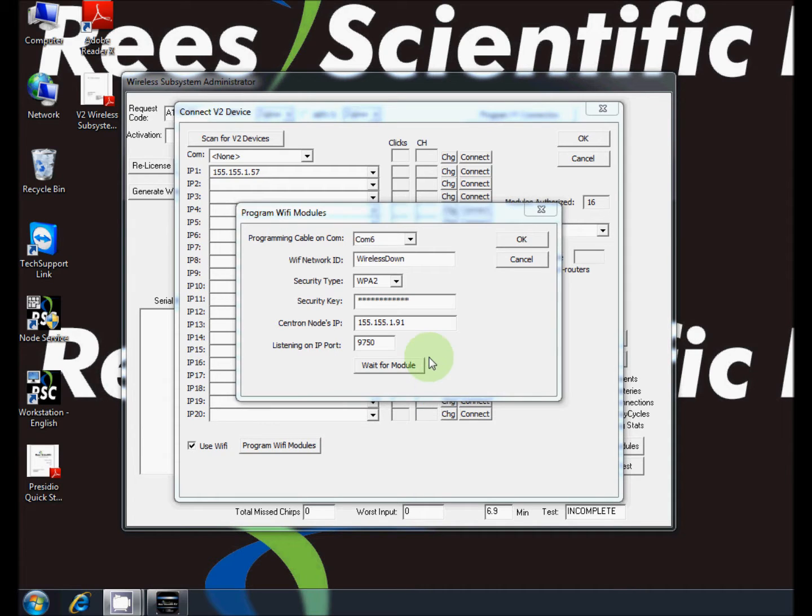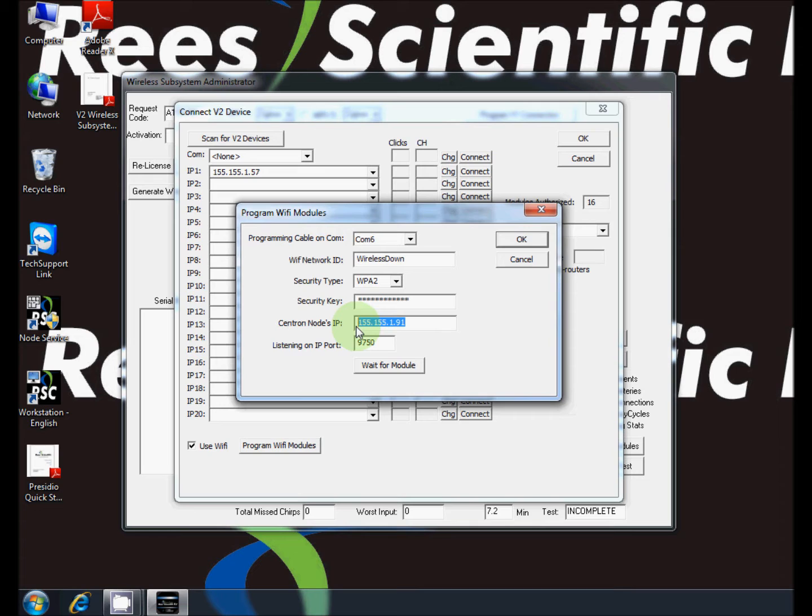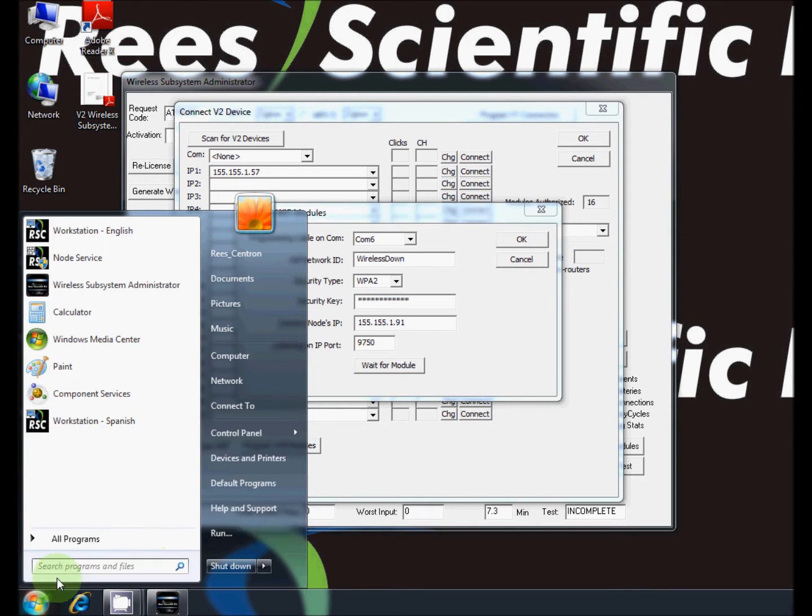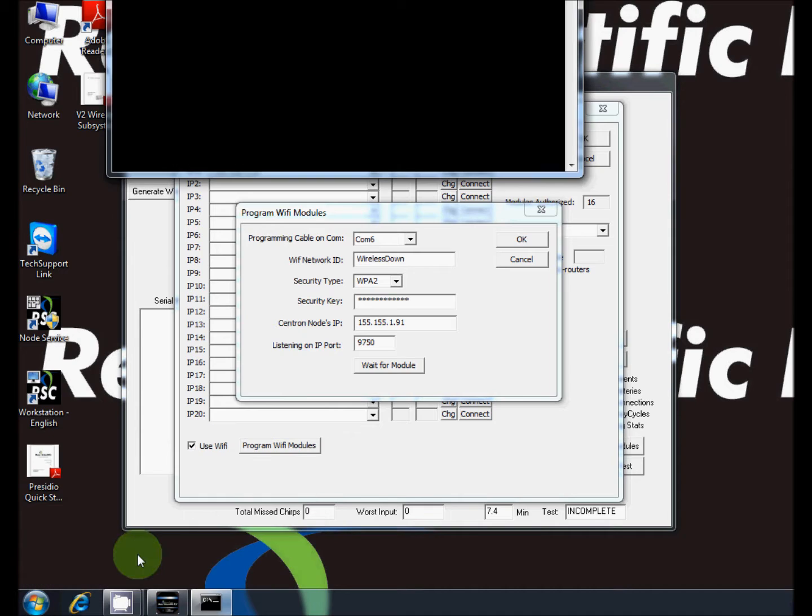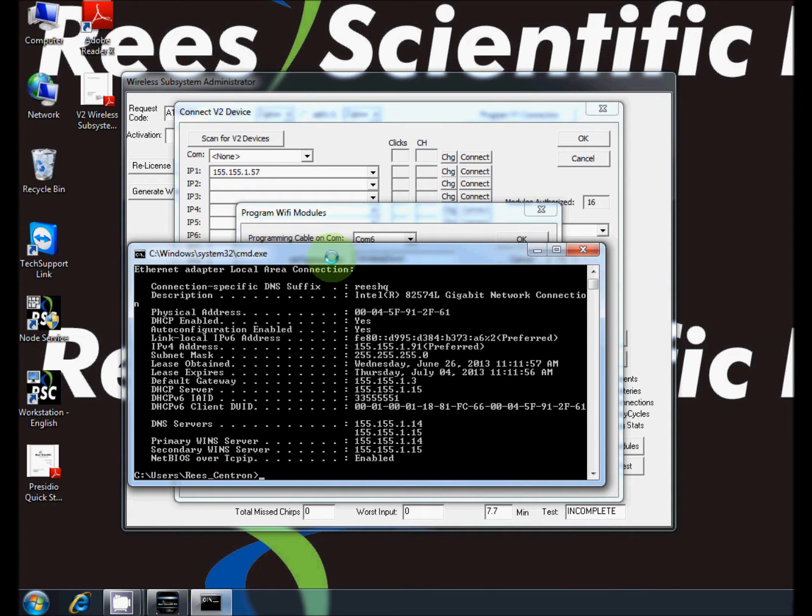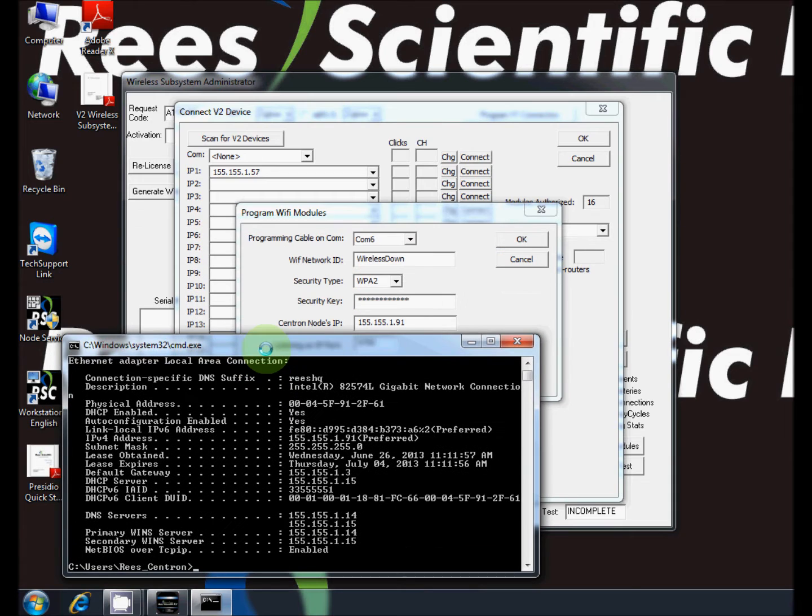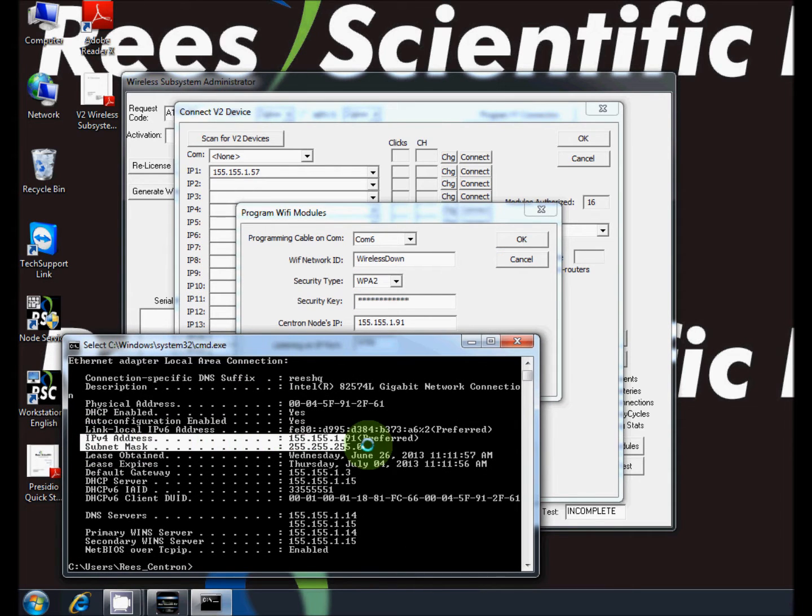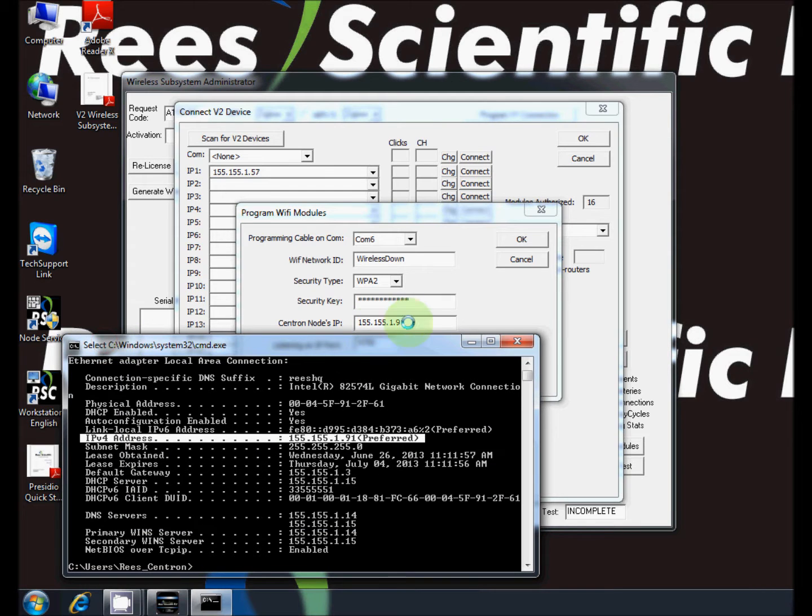Enter the correct information for the wifi network. The Centron nodes IP is the IP address of the computer. This can be verified by opening command prompt and typing ipconfig slash all. Here you can see the IP address and other useful information such as the subnet mask and physical address.